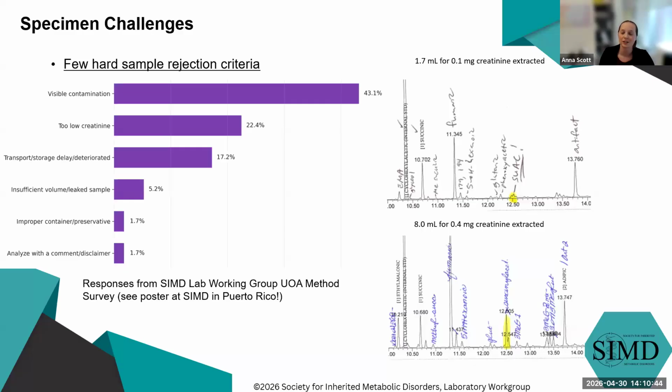For our method, we like to target 0.7. So this is a seventh of our target ideal urine amount. And yet highlighted there, we could clearly see abnormal excretion of succinylacetone in combination with the elevated tyrosine in the plasma amino acids. Slam dunk, we've got our diagnosis. We could plug that infant into care, get them on the clinic schedule, get them connected to the appropriate resources.